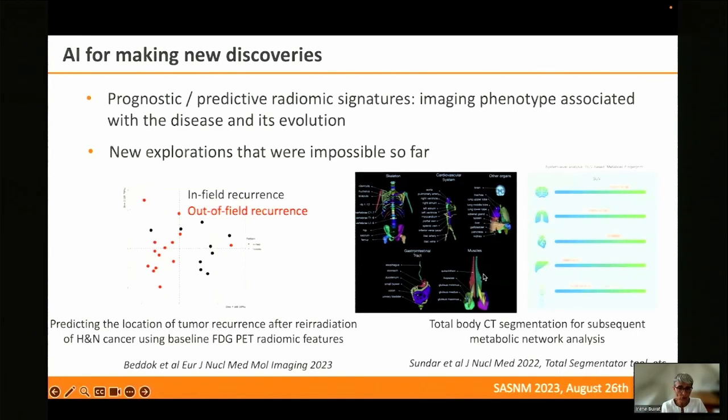And if we overlap that fully automated CT segmentation with the aligned PET, we can automatically estimate the metabolism in each and every organ. Hence, we can explore the metabolic footprint in subjects as a function of their condition. So this opens very novel research perspectives.